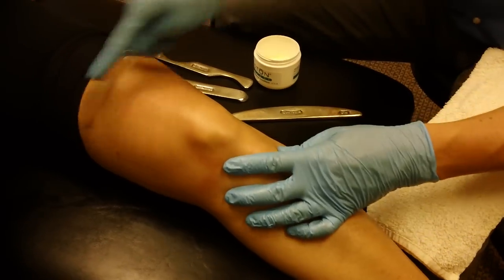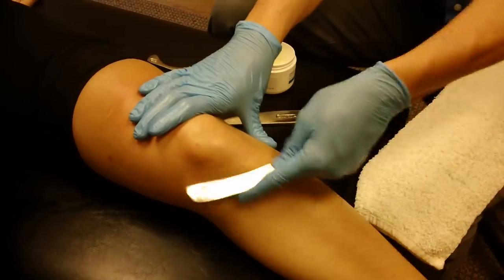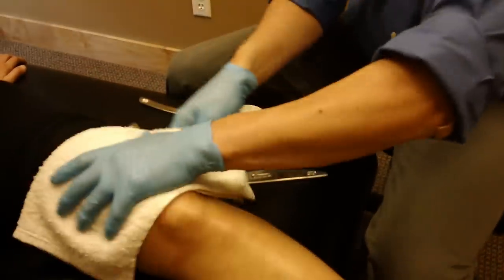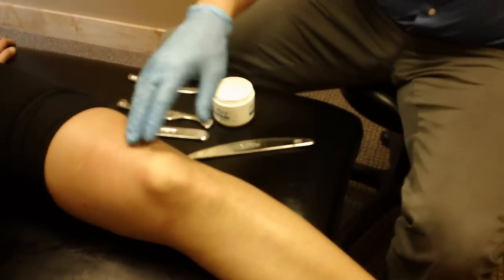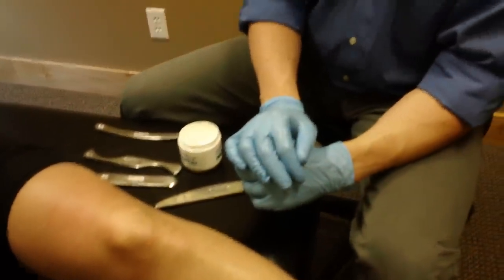Typically I would clean up just by working through the whole area with a less aggressive instrument. We would then clean up the emollient — a lot of times a baby wipe cuts right through that. And then applying some sort of topical pain reliever like a Cryoderm or a BioFreeze is a very effective way to finish.